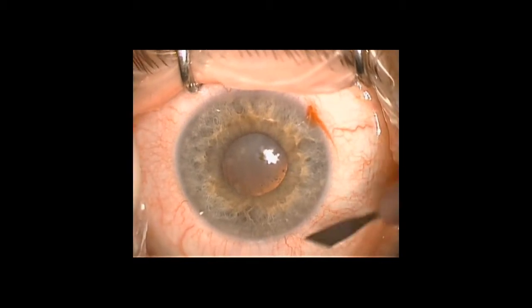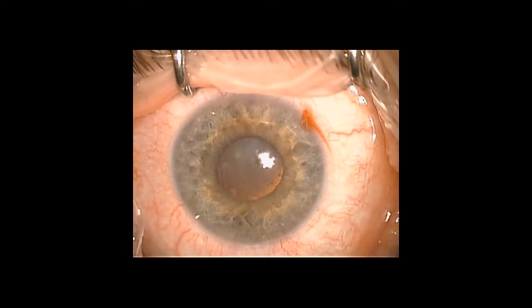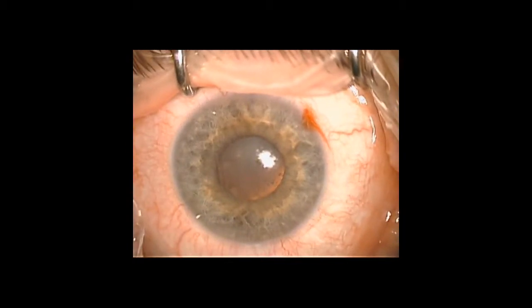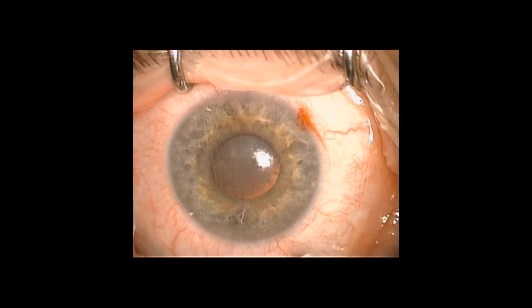This is immediately a complication which has to be addressed and is done so by using intracameral injection of dilute cyclopentolate and phenylephrine diluted in BSS.